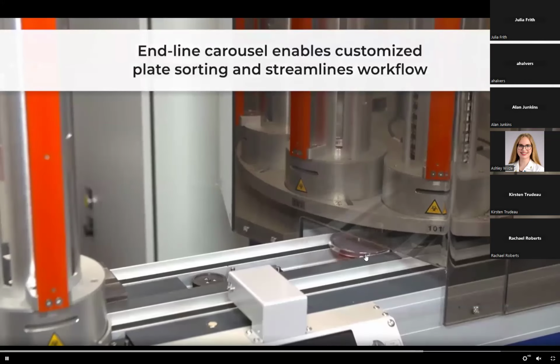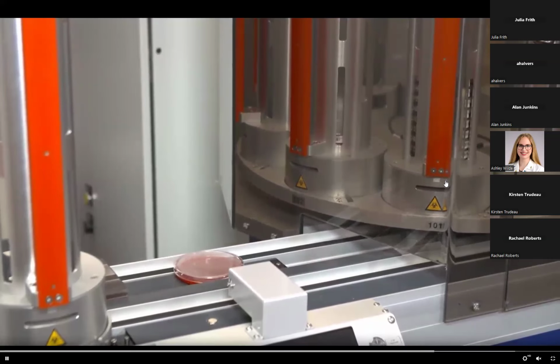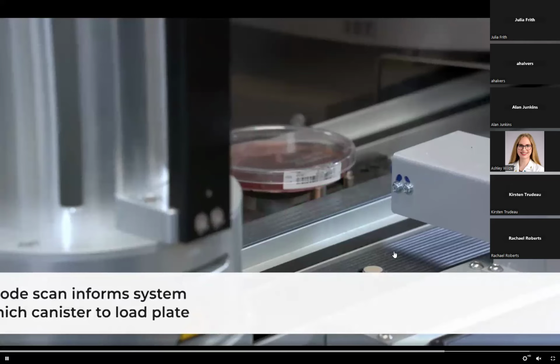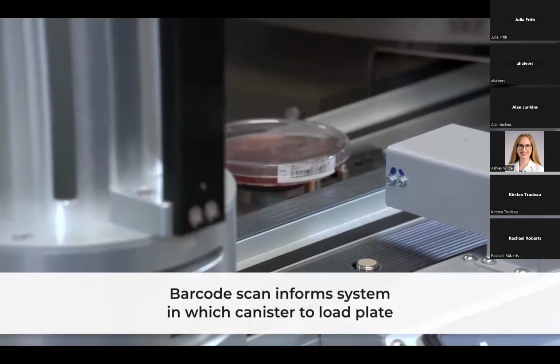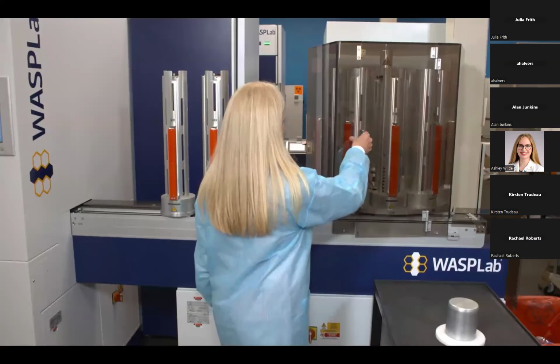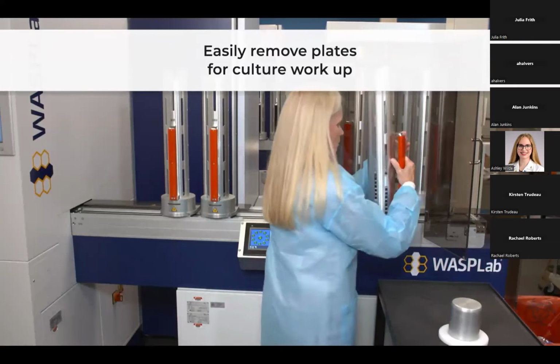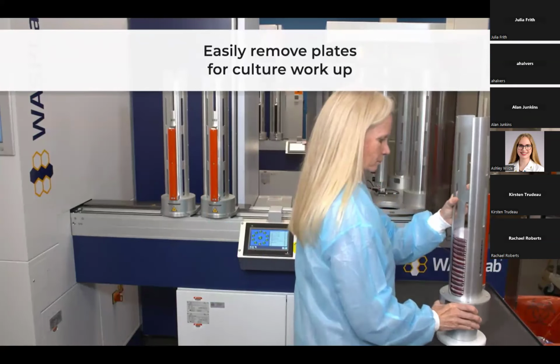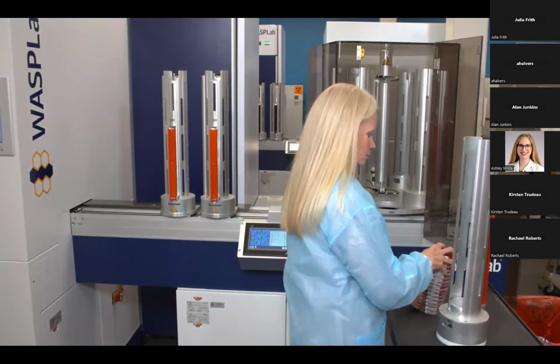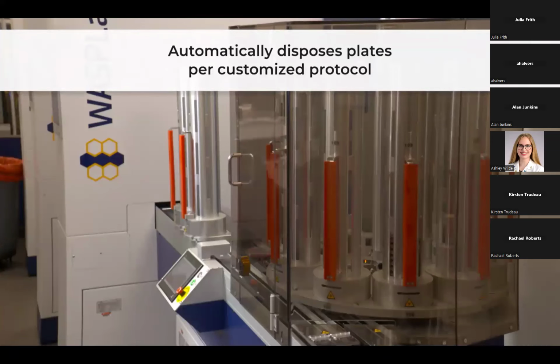These are the carousels. The plates will come out. If you call for a plate, it'll come out and get put in one of these carousels. And then Kathy's going to come along here. She's going to pull out that carousel to take the plates. There she comes. So these can be plates that you want to work up, or these could be plates that you say, okay, I'm going to take these, I'm going to put them in our morgue. We're going to save them for a week, just in case physicians call back and want extra workup done on those.